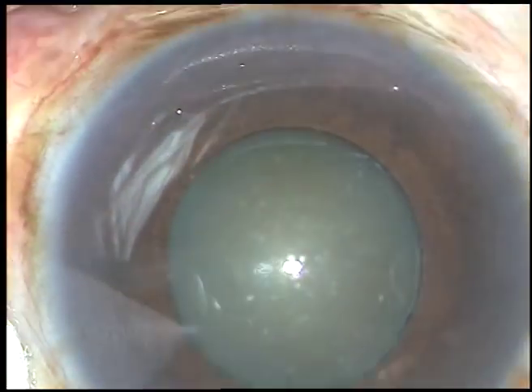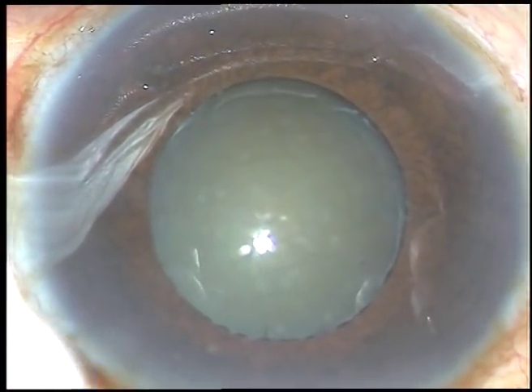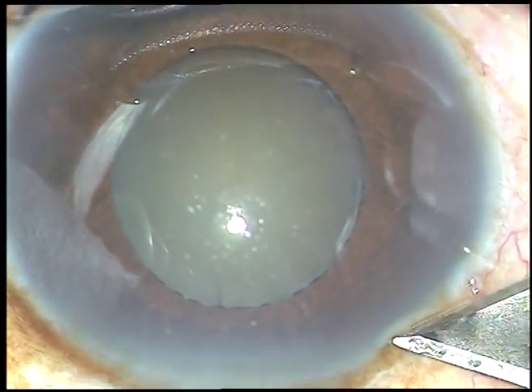Dear colleagues, this is a cataract with grade 3 nuclear sclerosis with small pupil. I have taken up this case for surgery. Let us watch the surgical steps.